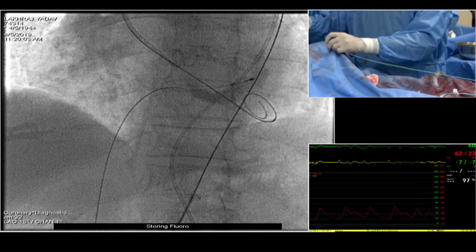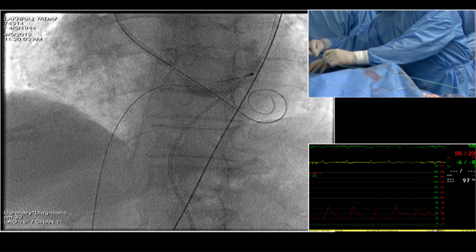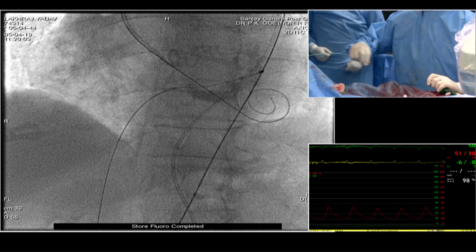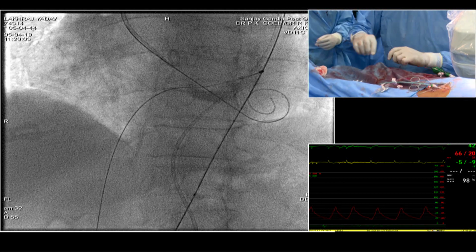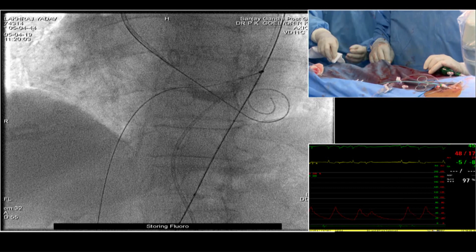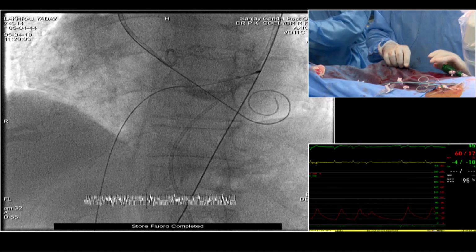What about the access? Do you use ultrasound or just angio-guided? Angio-guided. We have done the angio as I showed you. Does the annulus calcium, or the oblong aortic valve, have any bearing on your choice of valve? I think some pressure has to go up.